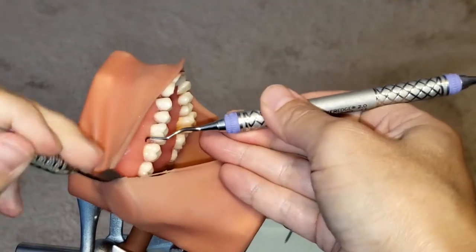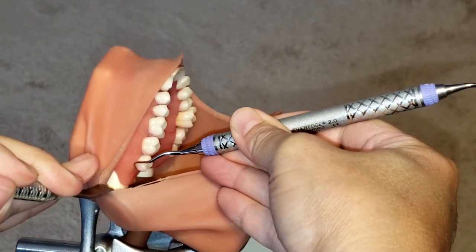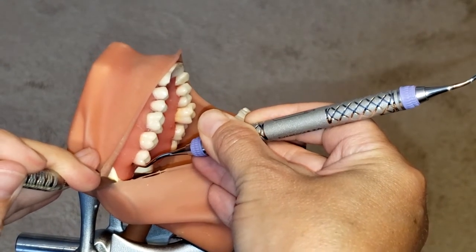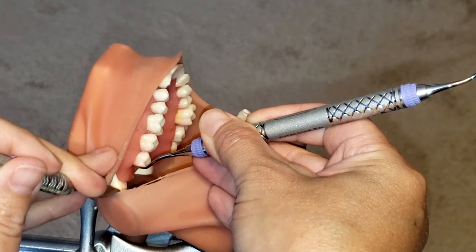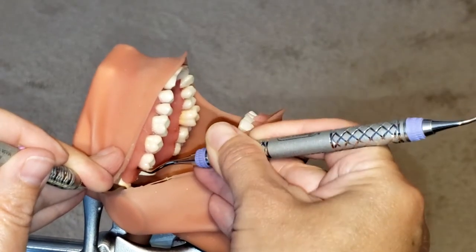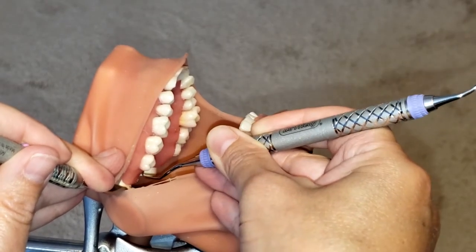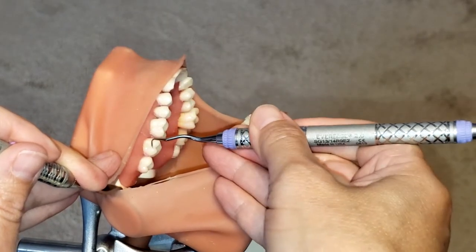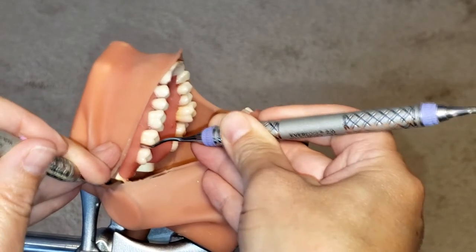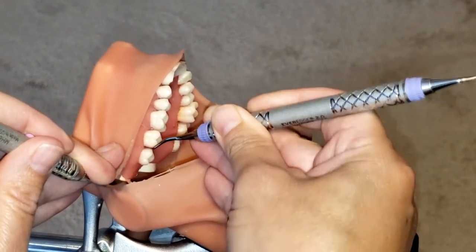Now I'm going to insert the instrument at the distal line angle, making sure that the toe is not sticking out or pointing outward. I'm going to make sure that the lower shank is as parallel as possible to the long axis of the tooth. Then to remove calculus, I want to make sure that I have that 70 to 80 degree angulation, and you want to make sure you are rolling into that proximal space. Start at the distal line angle, work your way gently under the pocket, begin to roll, and activate the instrument at a 70 to 80 degree angle.